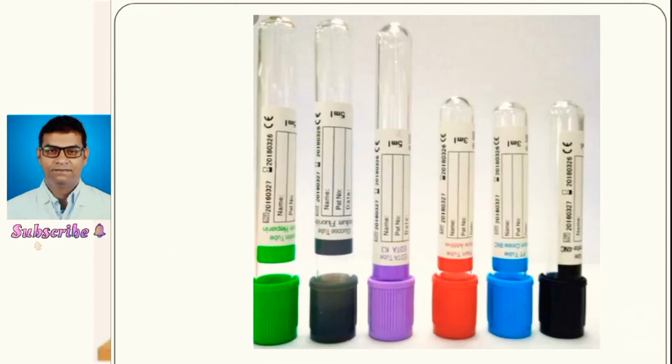EDTA is also known as Versene or Sequestrene. EDTA acts by chelating or removing the ionized calcium, and calcium is required for blood to clot. So when it is removed, the blood will not clot. Dry potassium EDTA is better than the dry sodium EDTA and dilithium EDTA.